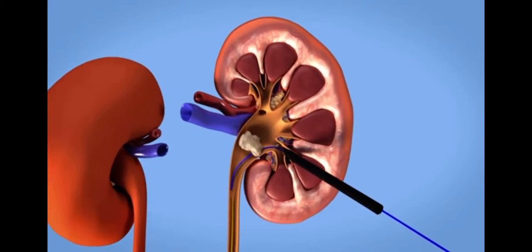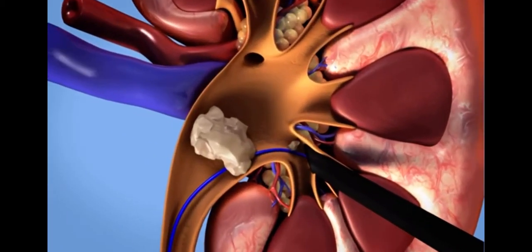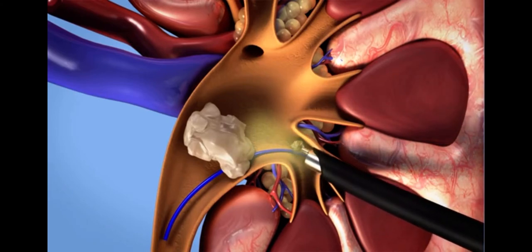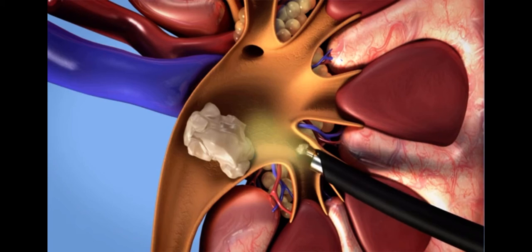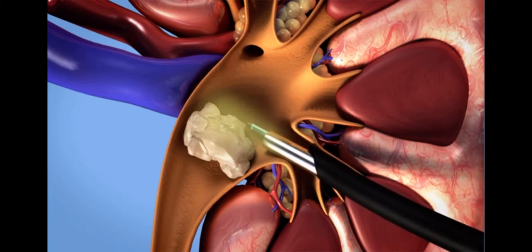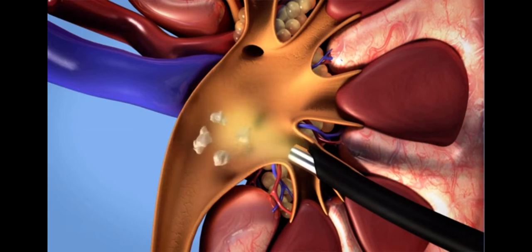The guide wire allows the nephroscope to safely access the kidney. Some stones can be removed directly using a grasper. Larger stones need to be fragmented first, using a device like a laser, before extraction.